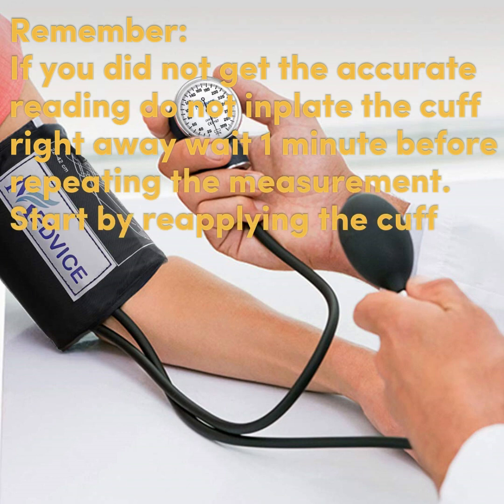Remember, if you do not get an accurate reading, do not inflate the cuff right away. Wait 1 minute before repeating the measurement. Start by reapplying the cuff.